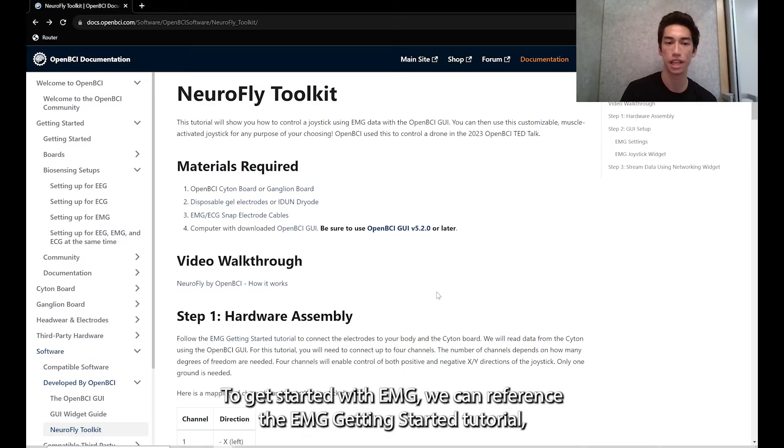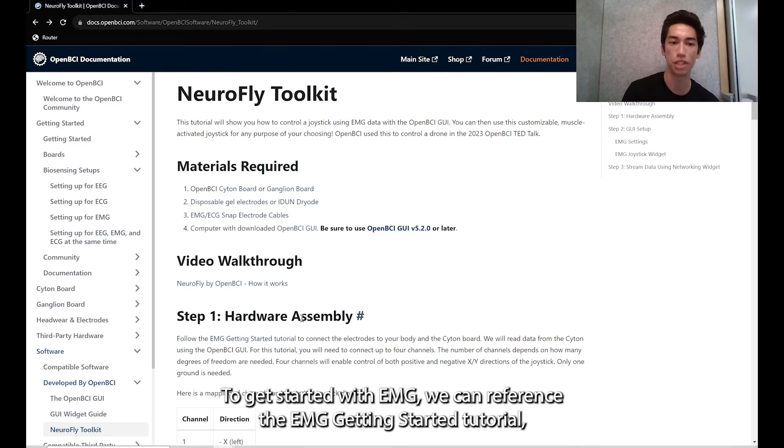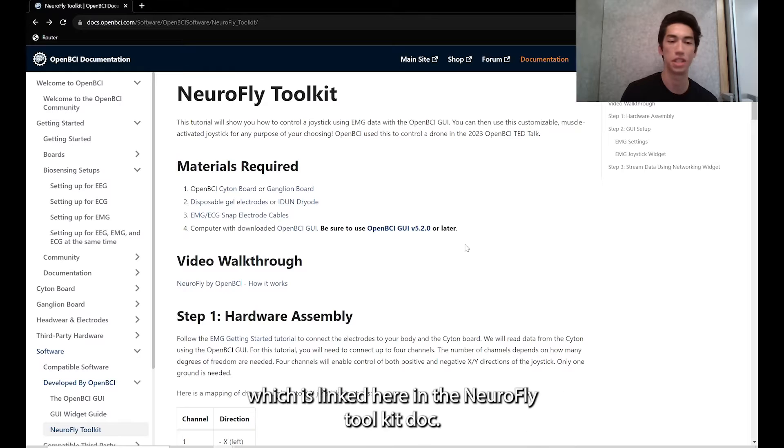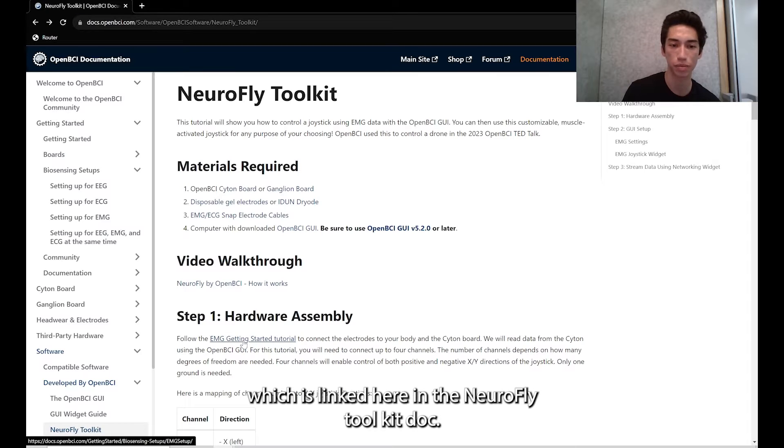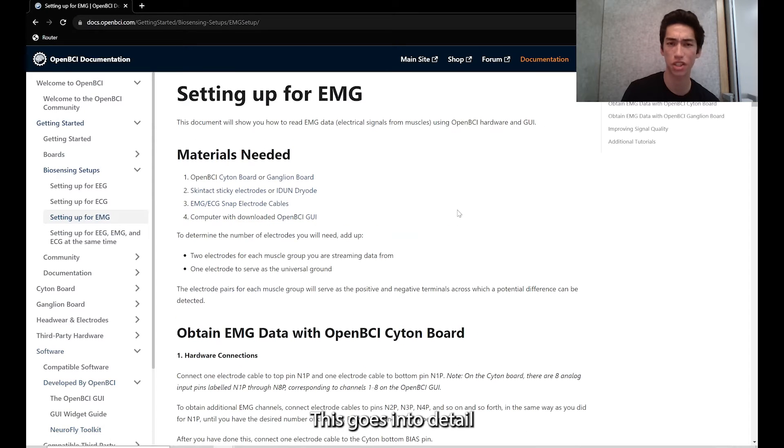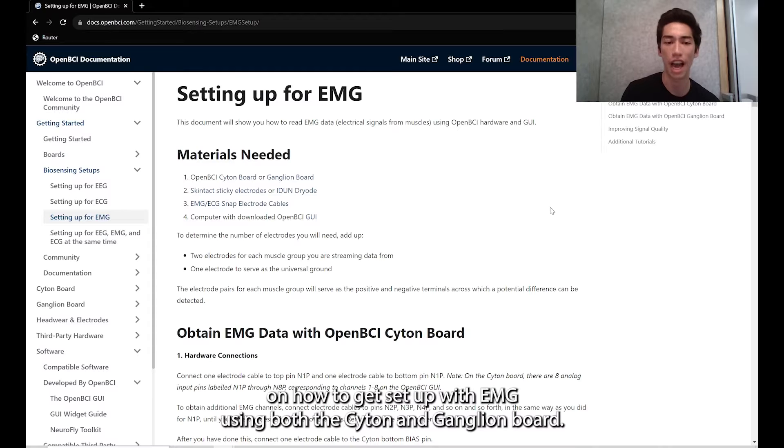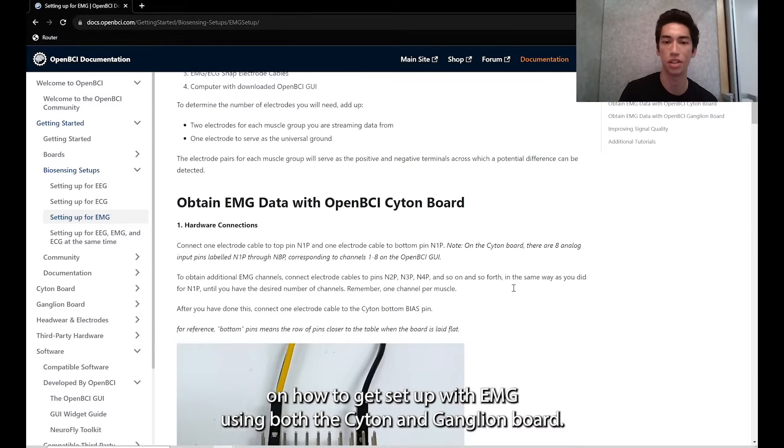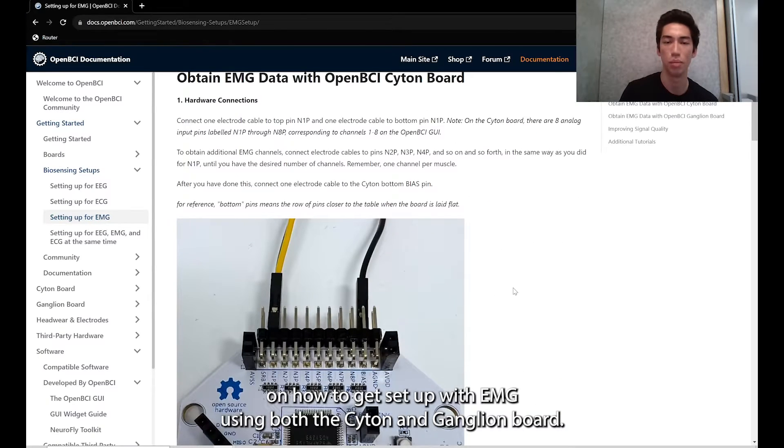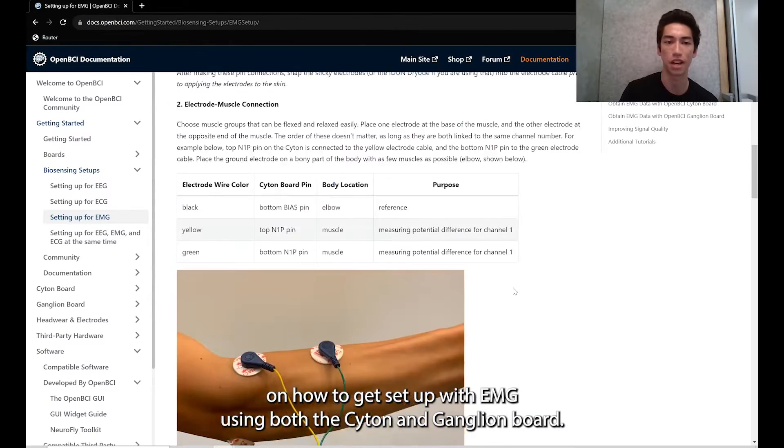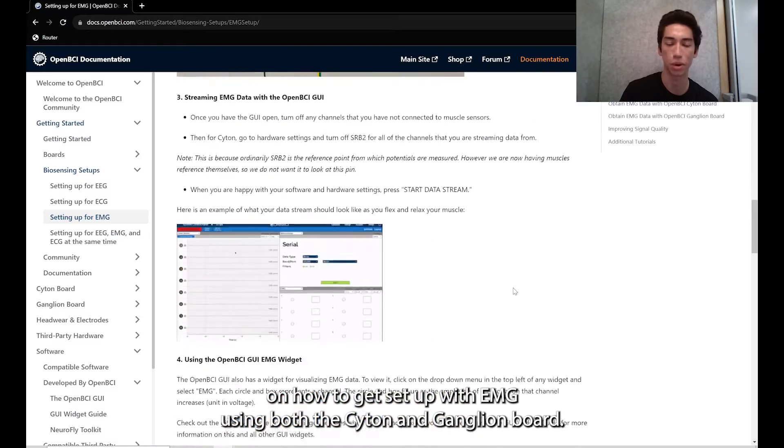To get started with EMG, we can reference the EMG getting started tutorial, which is linked here in the Neurofly toolkit doc. This goes into detail on how to get set up with EMG using both the Cyton and ganglion board.